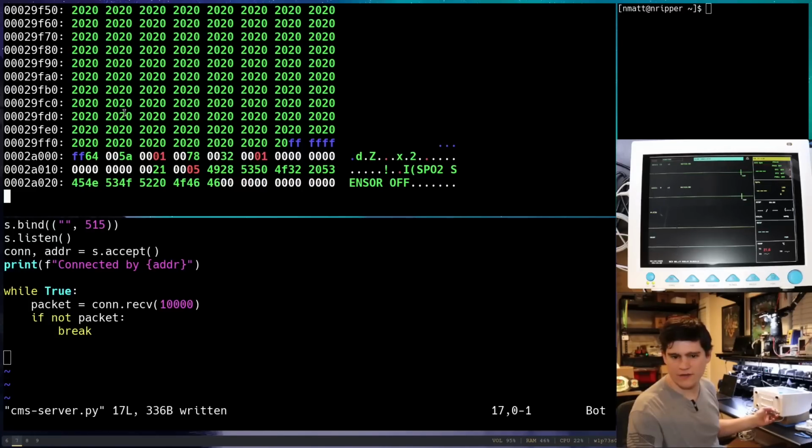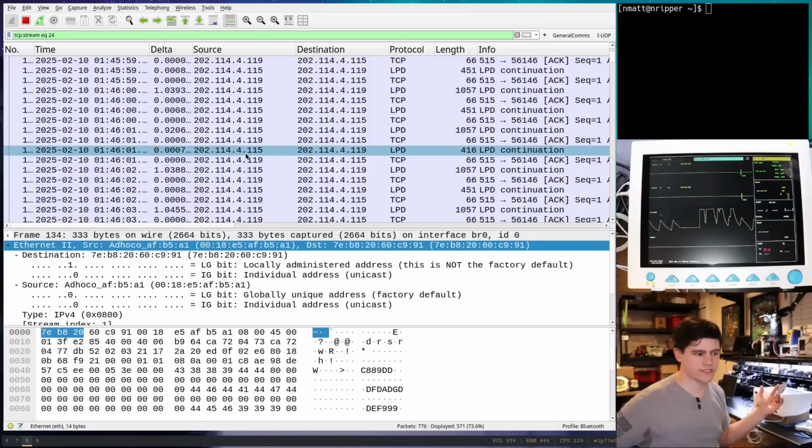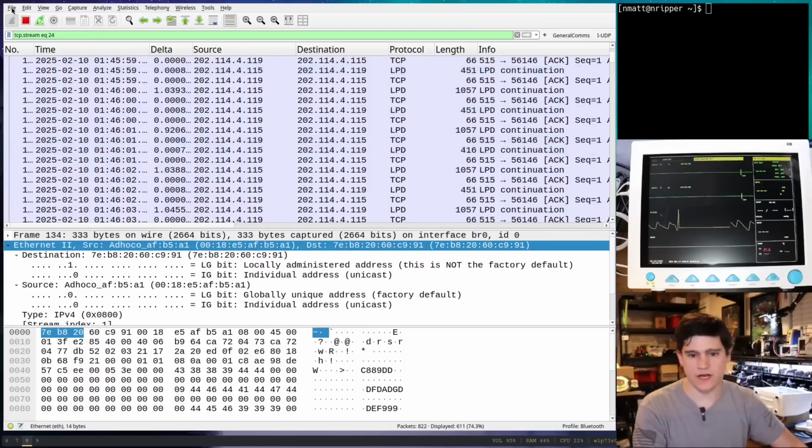So we have our little fake server running here. And so we got the PCAP. And so I have to wait for it to get a full set of readings, and then I should get numbers up there. Okay, cool. 74.99 or 73.99. Awesome. But 99 was a constant number that I saw there.